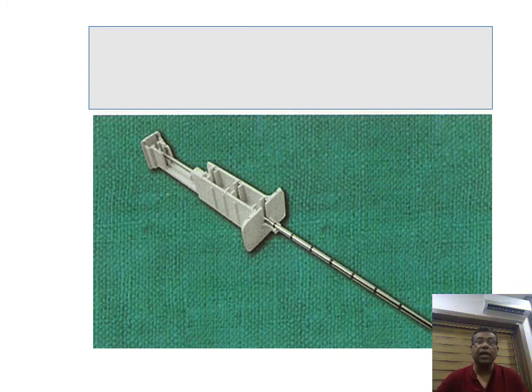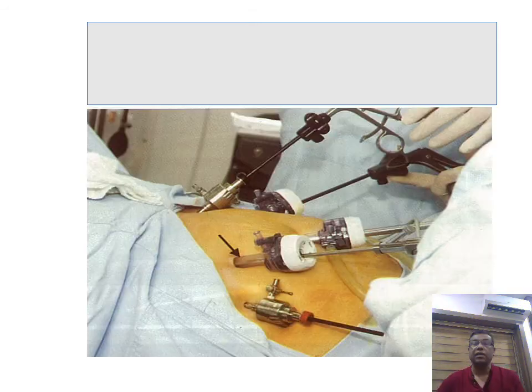These are called Tru-Cut needles or core needle biopsy needles, used for taking core needle biopsies. These are laparoscopic trocars — available in 10 mm and 5 mm sizes for various laparoscopic procedures. They have a valve that allows instruments to go in but does not allow gas to come out, and they are usually self-retaining once inserted. Trocars can be transparent — so you can see instruments going in and out — or metallic.